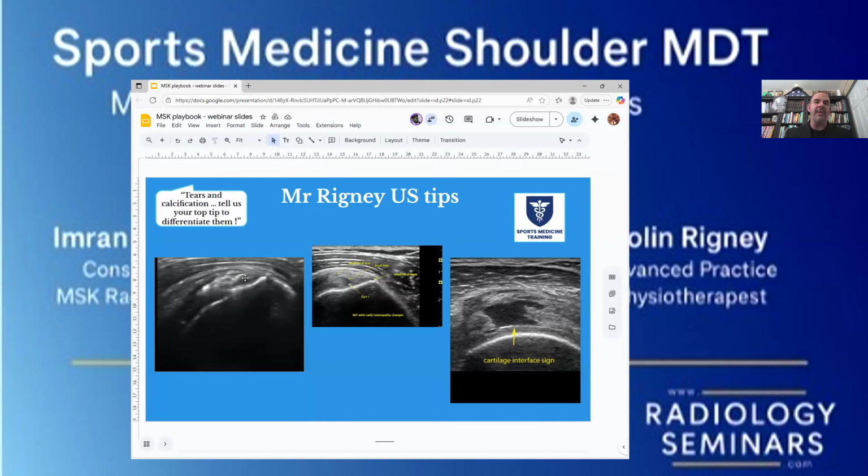Okay, when you see this calcification in the tendon, you have to assume there's a level of tearing, and it's more like fraying. So I tell patients when we have this finding, the tendon is grossly intact. Okay, but there's no way that there's not a level of fraying going on secondary to that calcium. So I tell people, like when you have an old pair of pants or jeans or shirt that's kind of fraying at the seams a little bit, that's kind of what goes on with this finding, right?